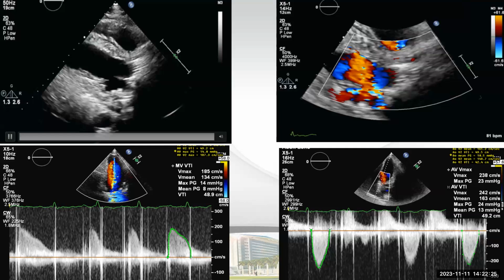However, they said up to 8 is still considered normal in most cases, especially if this is the same as post-operative. But if it's raised compared to post-op, that means some stenosis or high gradient. Even some valves up to 10 is considered a normal gradient. However, as I said, we always have to compare to the post-op gradient. So this is still considered normal.